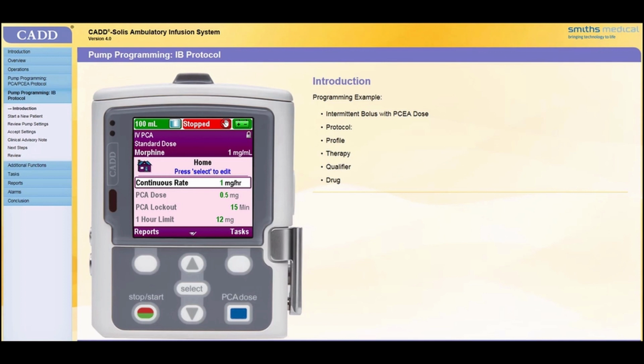The protocol you will see during this training is just one example of a protocol configuration. Some facilities may choose to use profiles. Profiles contain a grouping of protocols. For example, profiles can be defined for specific care areas, etc. If your facility has chosen to use profiles, then selecting the correct profile will be part of the programming process. For this training, the code 123 will be used.